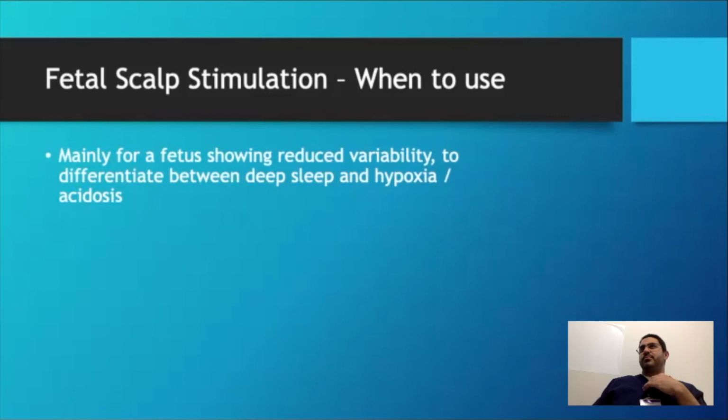Just kind of like what I've just said. So there's no cycling, maybe. There's no cycling, as in baby stuck in wake phase or sleep phase. Well, no cycling means both, so you have to specify which one. Sleep phase is what we want to figure out: reduced variability and no responses. Where's the baseline? It could be high, or it would just be normal, you'd imagine.